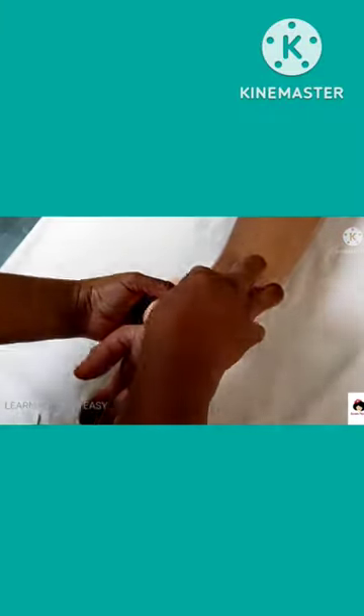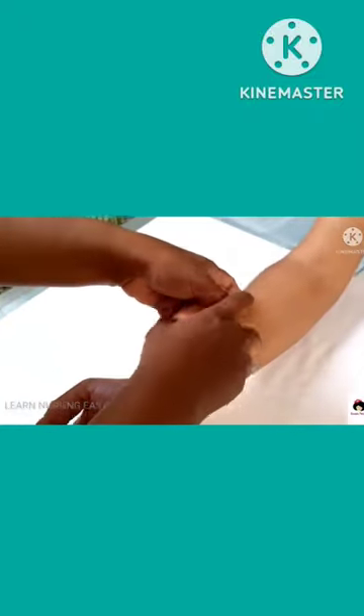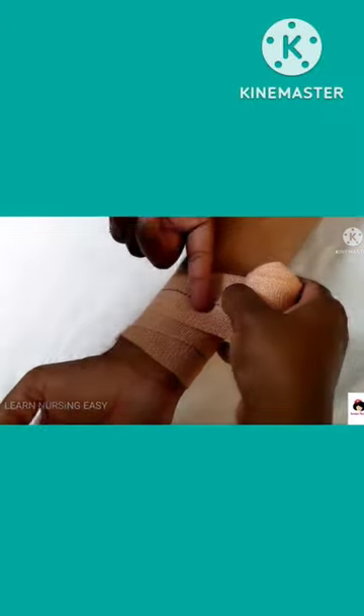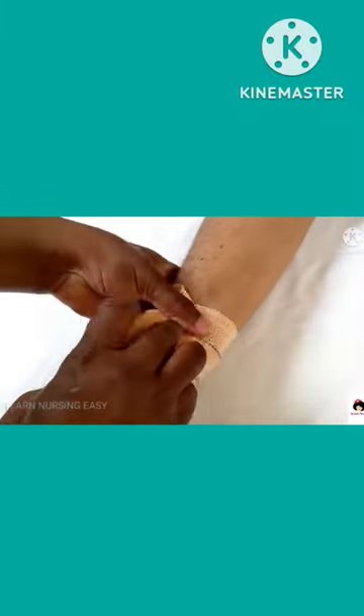In reverse spiral, you have to make first one circular manner rotation and then next is spiral rotation. And then when you make the next turn halfway in the forearm, you have to keep your fingers two-thirds and make a reverse turn like this.